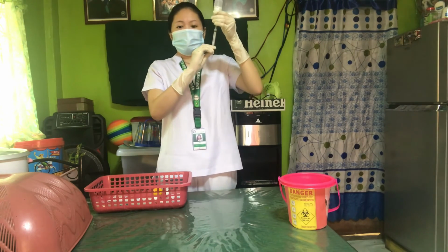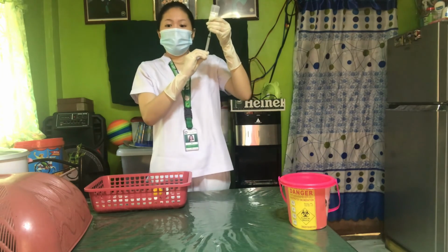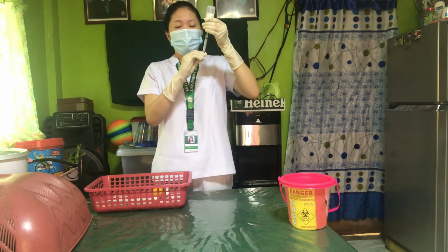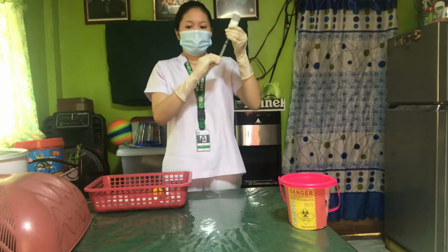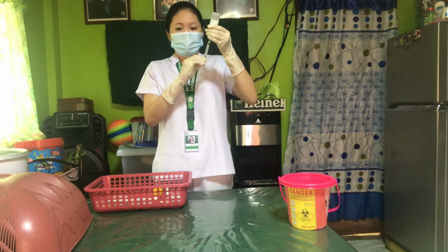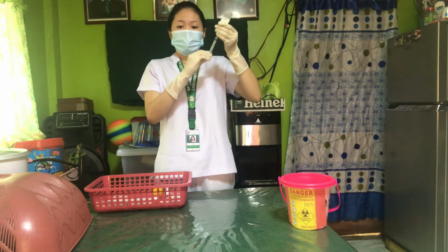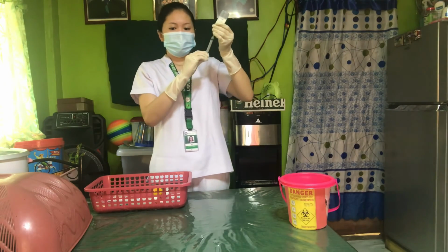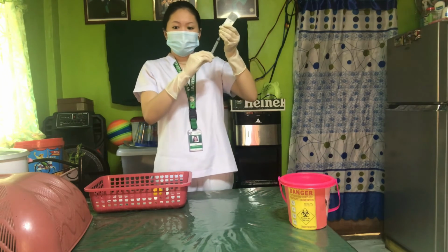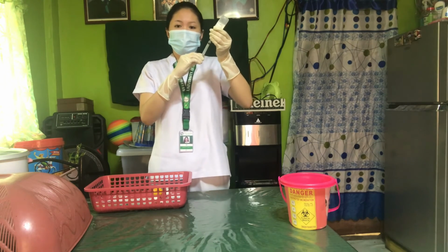Next is withdraw the prescribed amount of medication, either A or B. A is holding the vial down, moving the needle tip so that it is below the fluid level. The vertical position makes the removal of air bubbles from the syringe easier. And B, inverting the vial, ensuring the needle tip is below the fluid level and gradually withdraw the medication, which is what I am doing right now. Inverting the vial prevents air from being aspirated into the syringe.